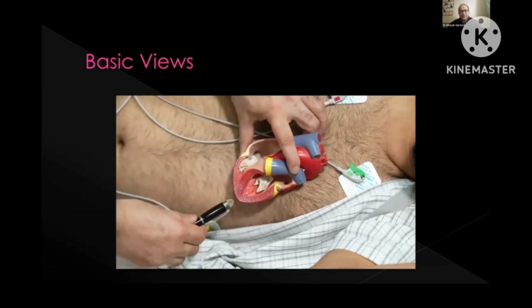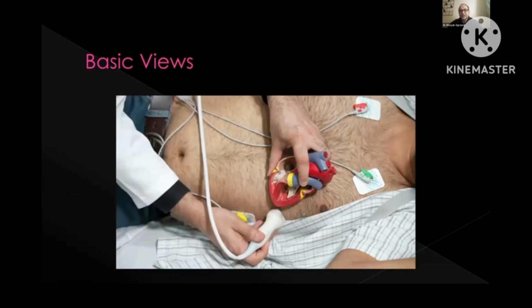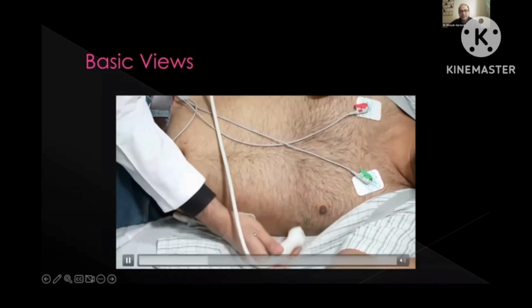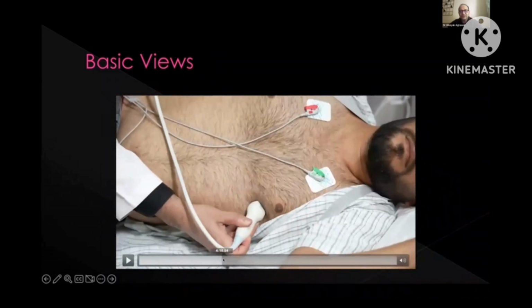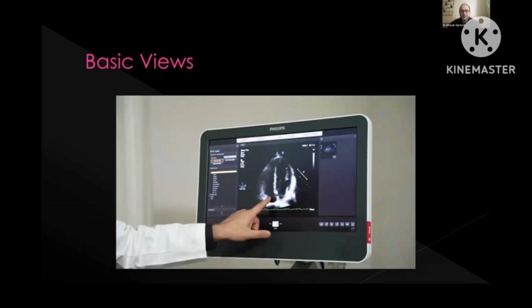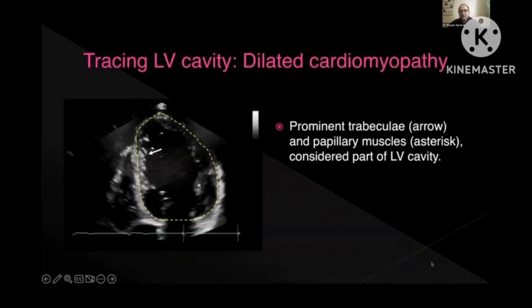And this video explains how you put your cursor, and when you put your cursor, how you get a 4-chamber view here. This kind of basic structure is what we have created, something almost like hand-holding, showing you the echo-anatomical correlation. So that's number one. Going forward, we will show you the basic flaws which we see in echocardiographic pictures today.